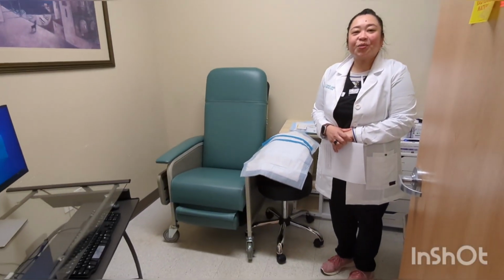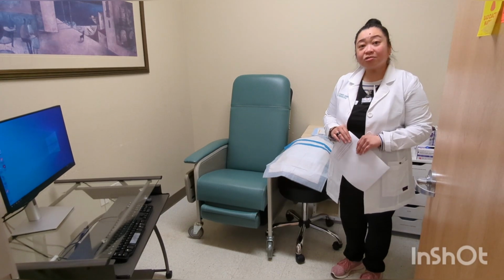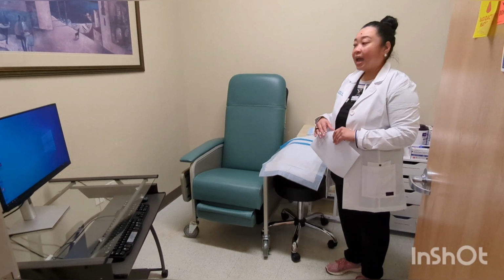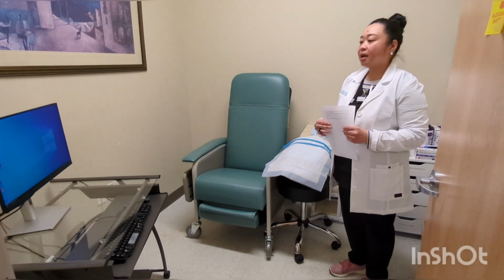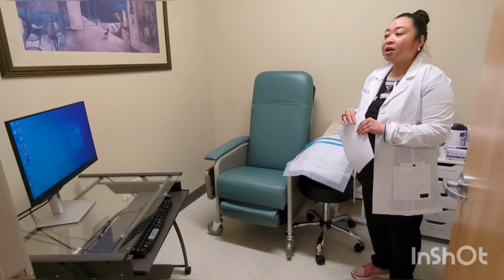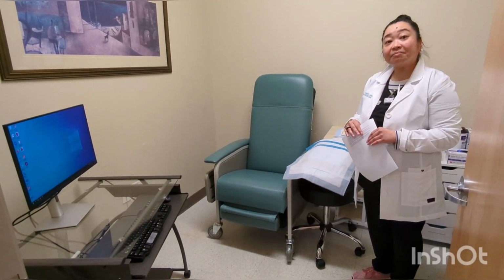So let me walk you through the scan process. Typically our patients go through 2 scans. The first scan is called the concentration scan. I have them sit here and I start with an IV first. And then after I've established an IV, I have them take a computer test that will stimulate their brain. Here we use Conners' Continuous Performance Test. The stimulation test will take about 14 minutes.